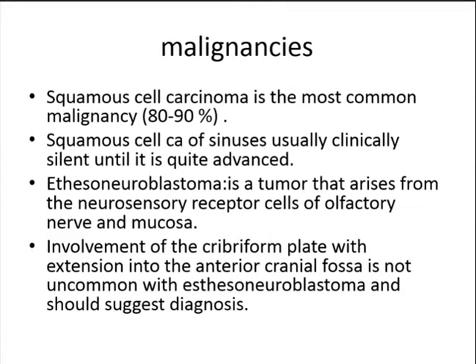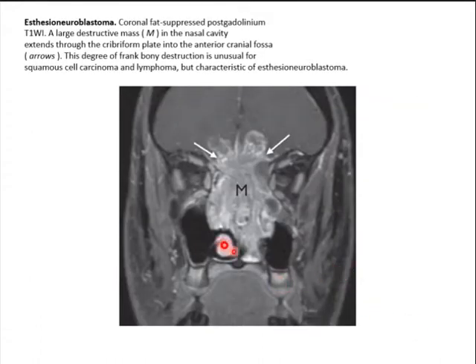Malignancies of the paranasal sinuses include squamous cell carcinoma, which is the most common at about 90%, and is typically clinically silent until quite advanced. Another malignant pathology is esthesioneuroblastoma, a tumor arising from the neurosensory receptor cells of the olfactory nerve. Since it arises from the olfactory mucosa, it most commonly involves the cribriform plate extending into the anterior cranial fossa. Involvement of the nasal cavity and anterior cranial fossa should suggest the diagnosis. In this case, there is a mass lesion extending through the cribriform plate, which is almost destroyed, extending into the anterior cranial fossa with heterogeneous enhancement, suggesting esthesioneuroblastoma.